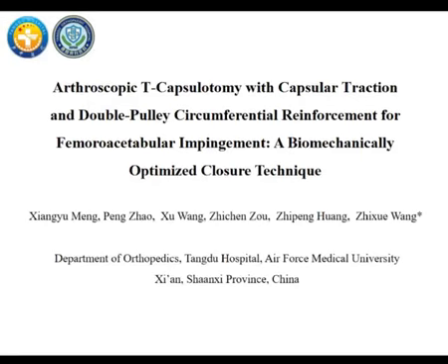Arthroscopic T-capsulotomy with capsule traction and double pulley circumferential reinforcement for femoroacetabular impingement, a biomechanically optimized closure technique.